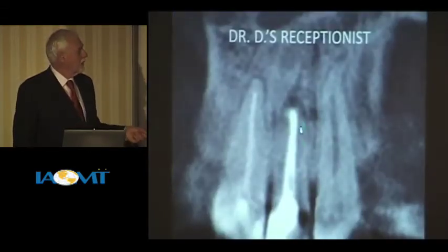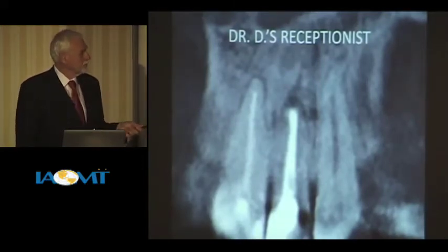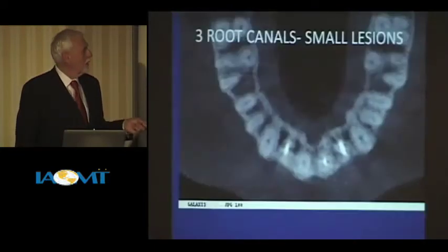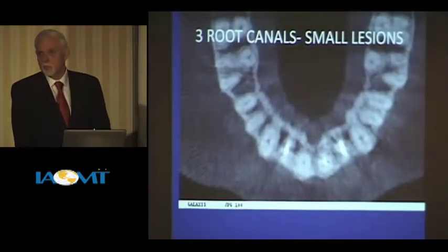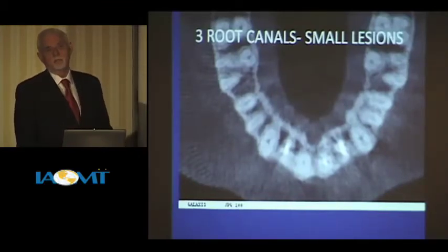This, obviously a couple of root canal treated teeth. This is a great naturopathic physician, sent her out of state, sent her receptionist down. We did a CAT scan. We saw 3 root canal treated teeth. They all had small lesions. Gave her that information, and she went home.